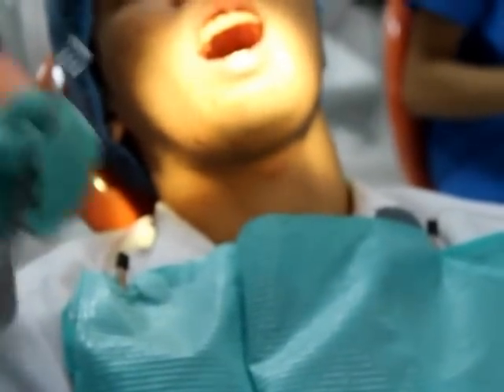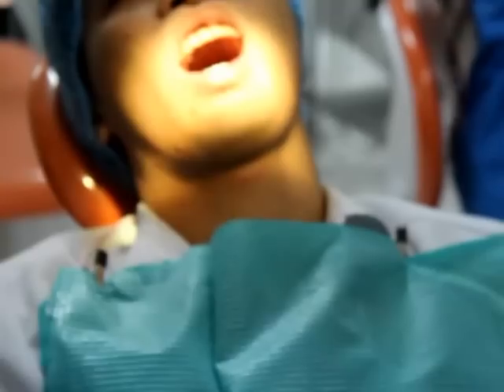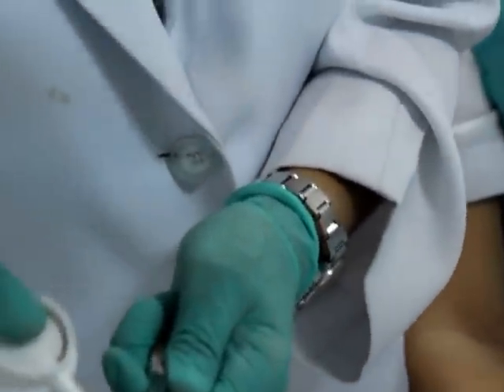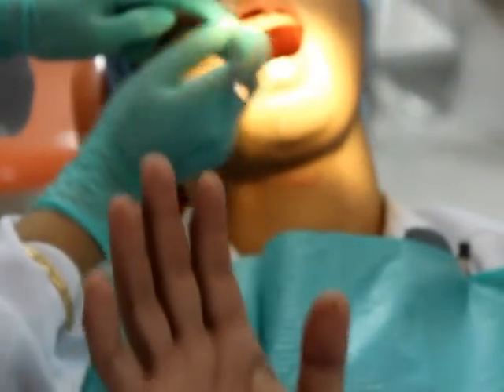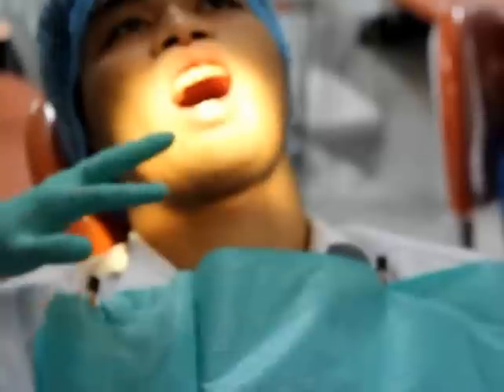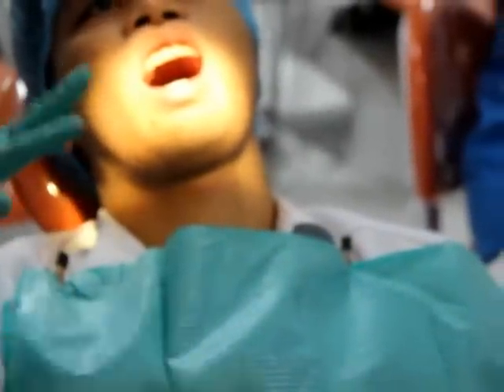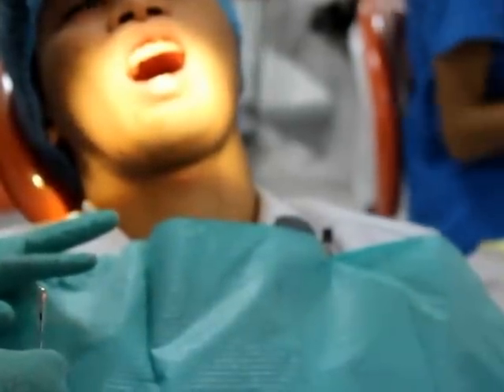Then you do it on the other tooth. If you do it on the other tooth, you have to get another. Shake it well. See? It's the same thing. 1, 1. Immediately. What does it mean? You have to interpret the result. The tooth is normal. The patient feels the same thing on the offending tooth and on the other normal tooth.